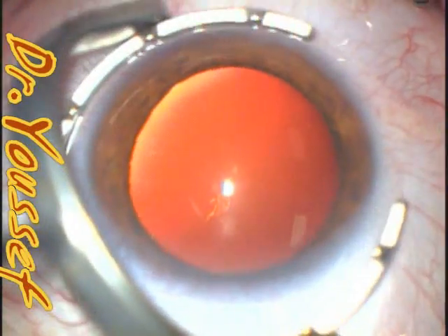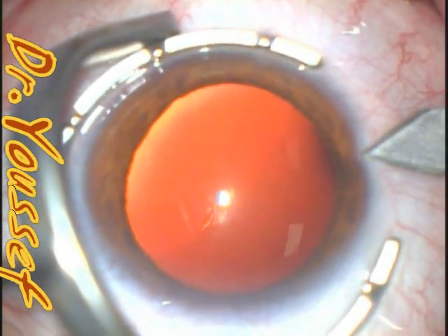I'm Dr. Yusuf. I'm going to be presenting you this case — a routine cataract case, or a case that appears routine until the end.